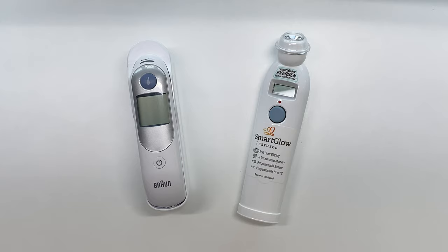So again guys, that is a quick look at the Braun Thermal Scan and the Exergen Temporal Scan — two of the most highly recommended thermometers on the market. This isn't a paid advertisement; I simply just have both these products at my house and I know a lot of people are looking for thermometers currently in 2020.